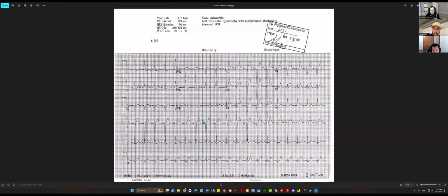If you can't find a P wave, or where the Q wave ends or ST segment begins or ends, look vertically up and down to find that feature on one of the other tracings. And that's where you know where it'll be.